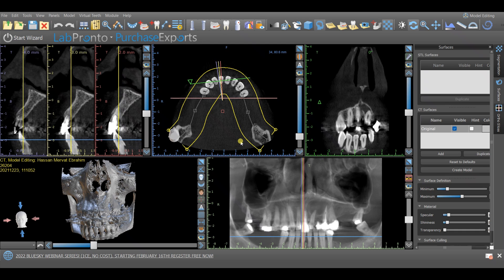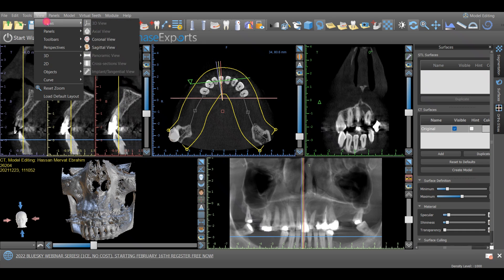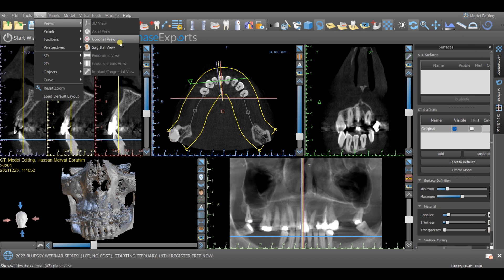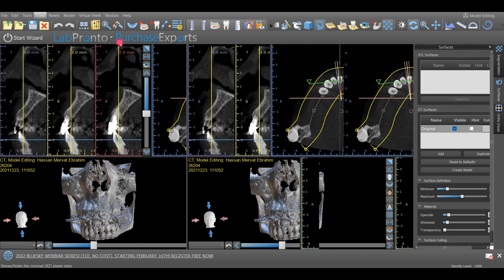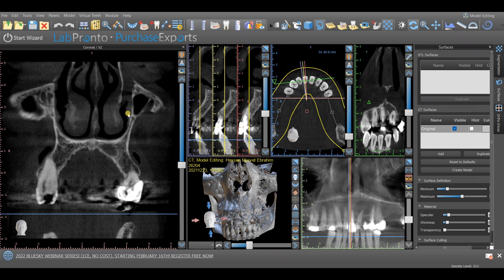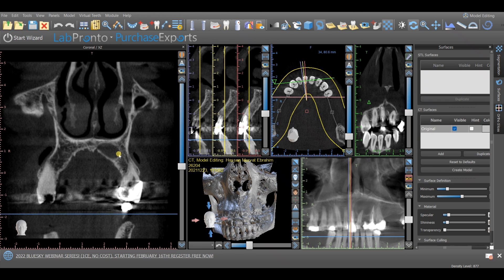To explain how this software works, let's say we want to see an axial view. We will go to View > Views. We have multiple views here: axial, coronal, sagittal, and so on. For example, let's say coronal view. As mentioned, the coronal view divides the body into front and back, so we are moving from the back of the head to the nose, or from the nose to the back of the head.